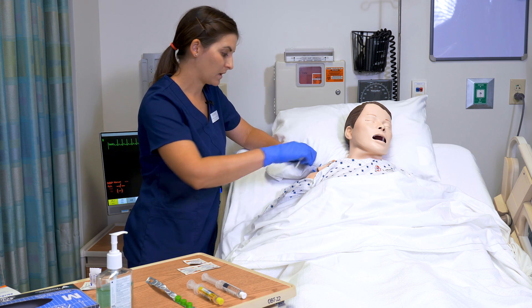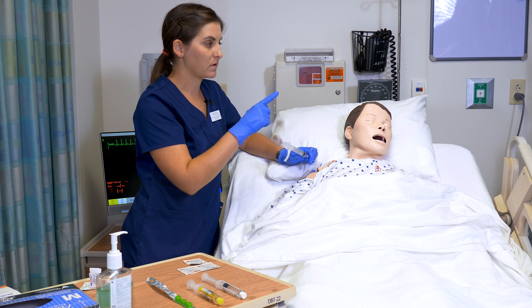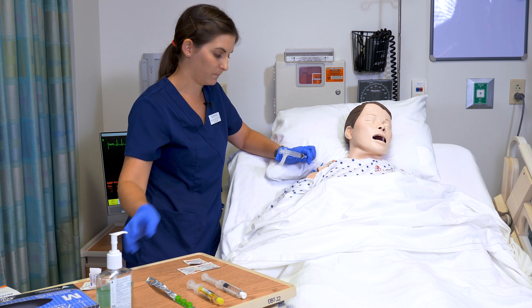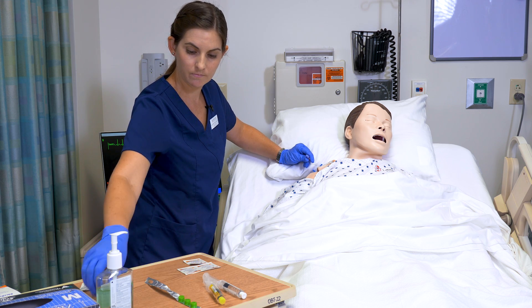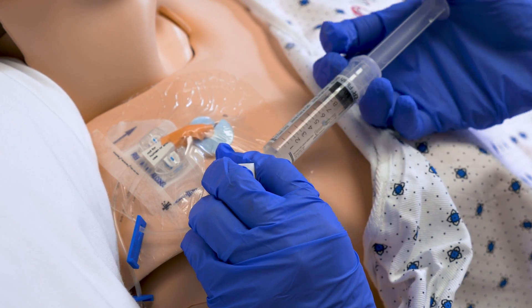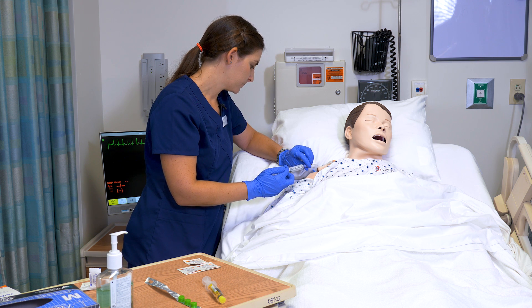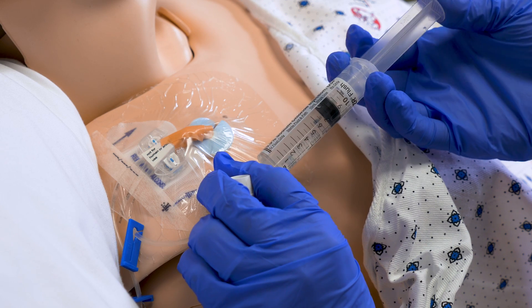I'll then administer my medication. I am giving a push IV medication — if you were giving an IV medication through the line as a primary or secondary, this is the point where you would attach your IV tubing. I'm giving my 1 mL of medication over 1 minute. I'm then going to use my second saline to flush the medication through the line. This lumen has a priming volume of 0.6 mLs, so flushing the first 1 mL over 1 minute will be appropriate to clear the line. The remaining 4 mLs I'm going to use a push-pause method just to clear the line.